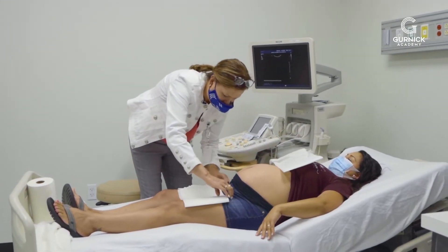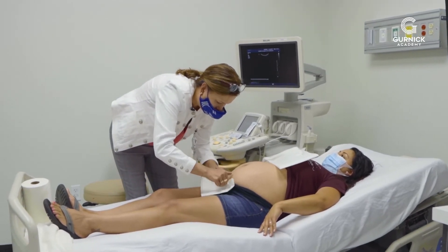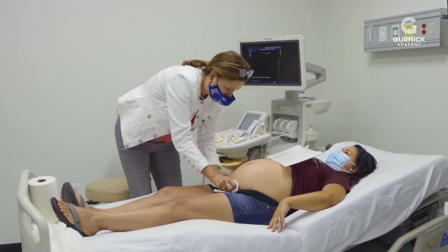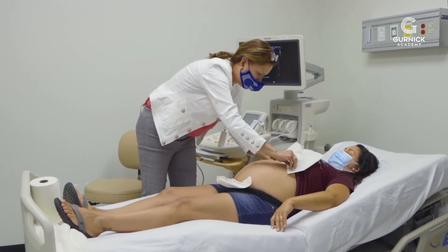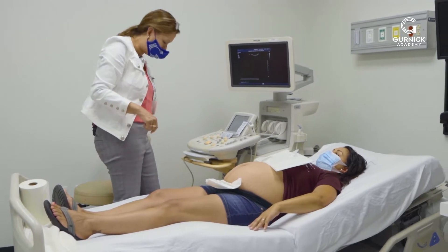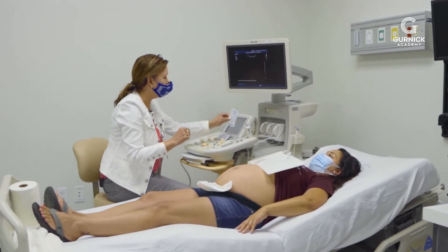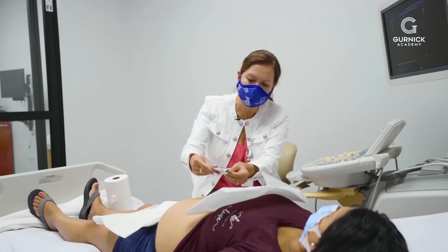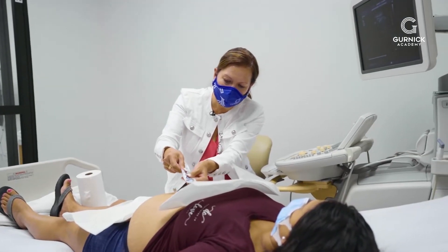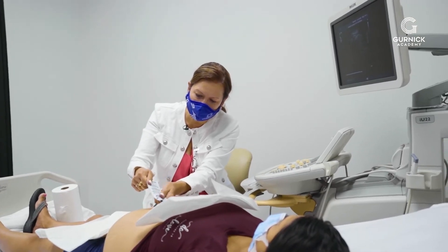We're just going to take a look and see how baby's doing. I'm just going to protect your clothing from the gel. Are you comfortable? Is there anything I can do to make you more comfortable? I'm just going to put some gel on your tummy — it might be a little bit cold — and it's going to allow me to see the baby.